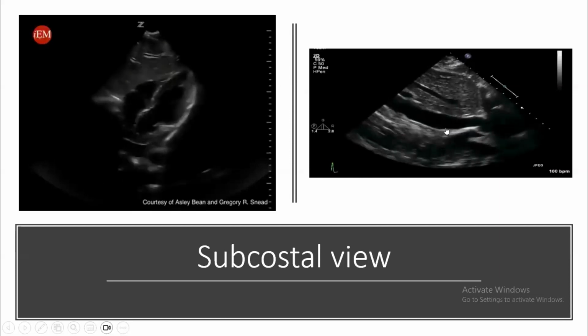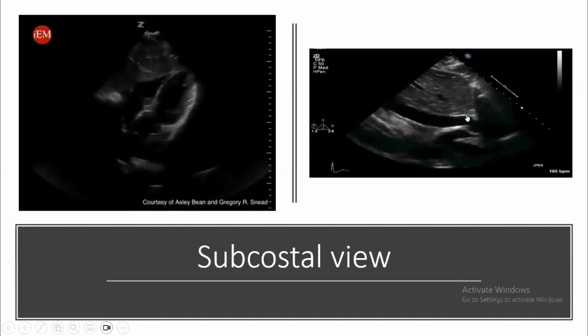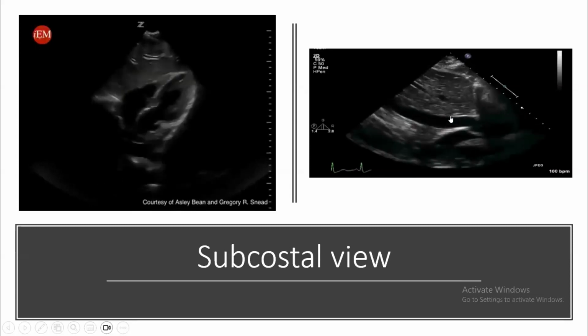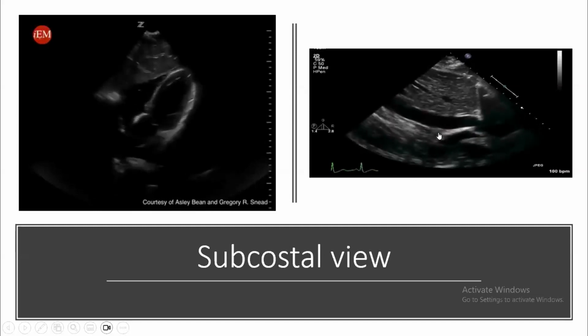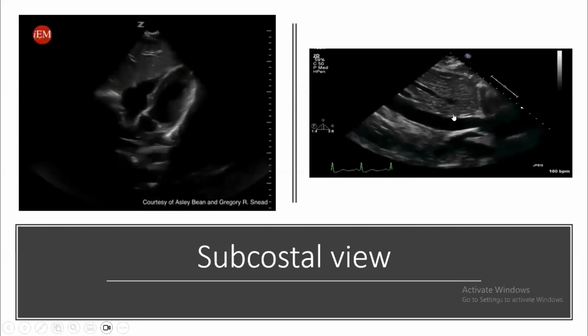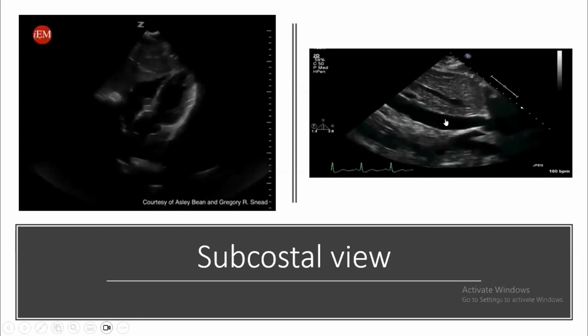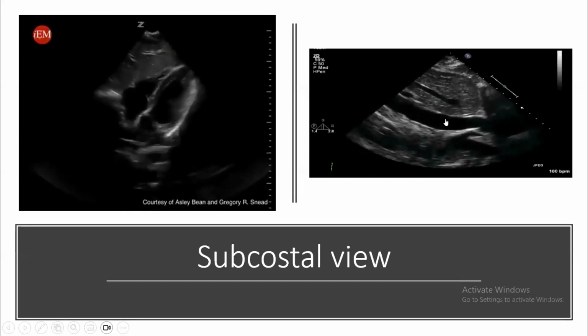What do you think about this? Right, the IVC. The IVC is normal. A normal IVC is 2 centimeters in diameter. You can measure it, or you can estimate it. Freeze the picture and measure it. But this is a normal IVC, and it is not collapsible or mildly collapsible. This patient has adequate volume.